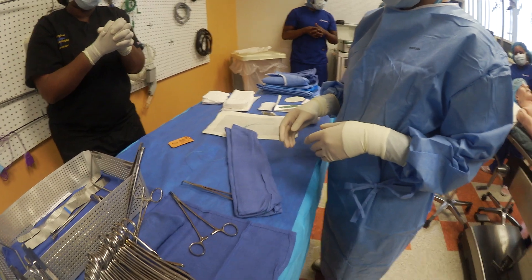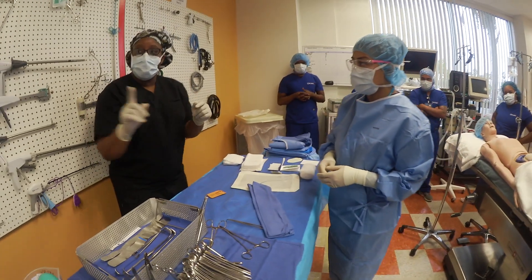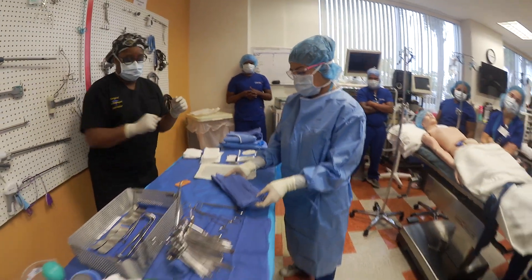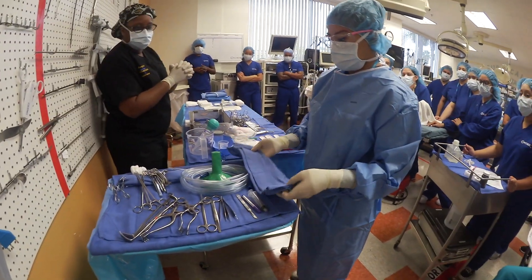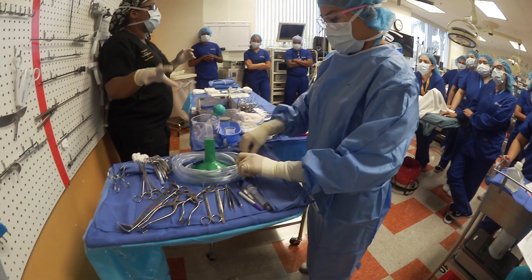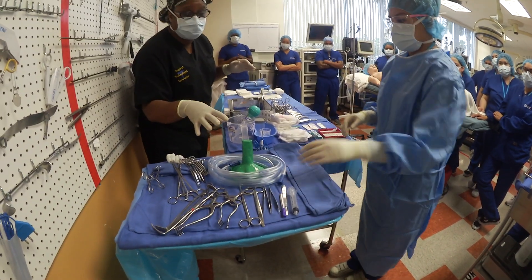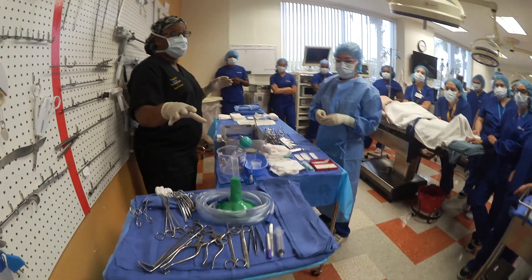Number two: demonstrate the hand signal for surgeon requesting a free tie, then pass the free tie to the surgeon. Per the sheet — place the towel on the Mayo stand. We are not going to dictate how you set up your Mayo stand. You set it up however you feel most comfortable and what works for you.